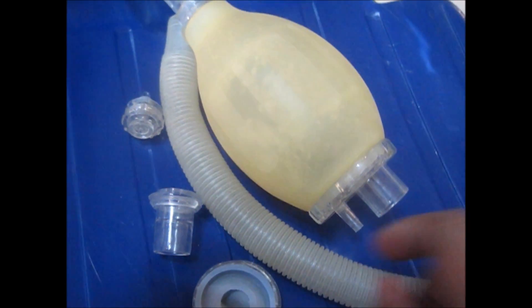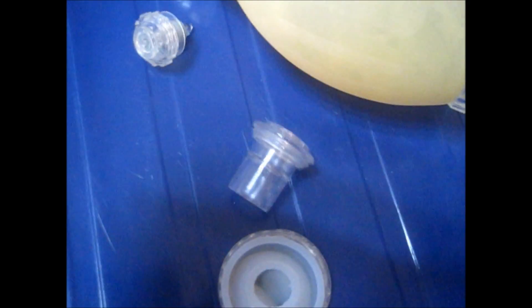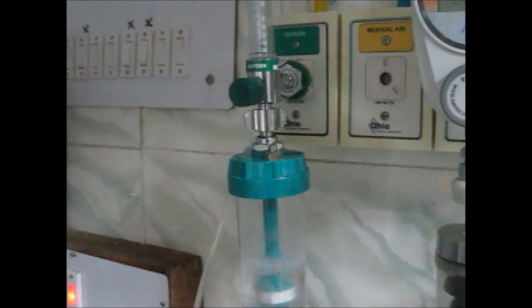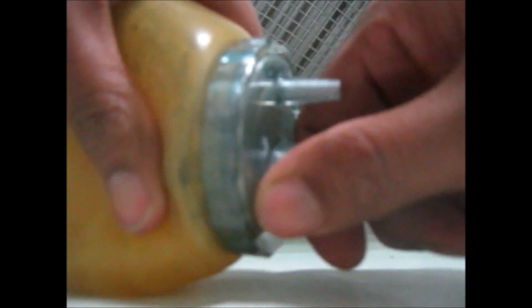The respiratory pressure should be around 35 centimetres of water maximum. When pressure exceeds this, air leaks from this valve. At the inlet, you need to attach the reservoir, and here you attach the oxygen.